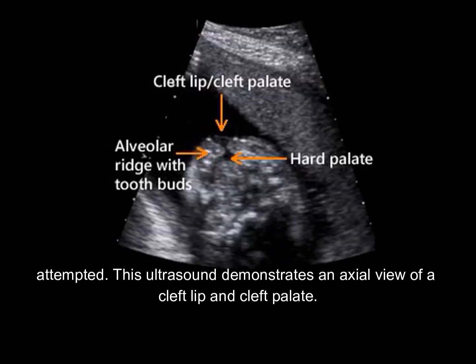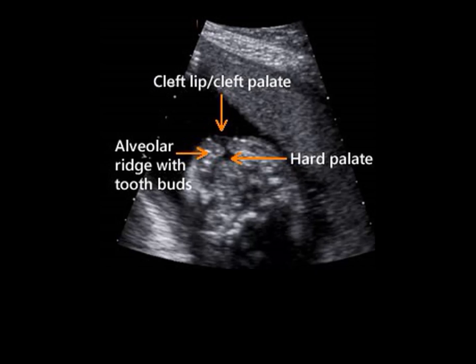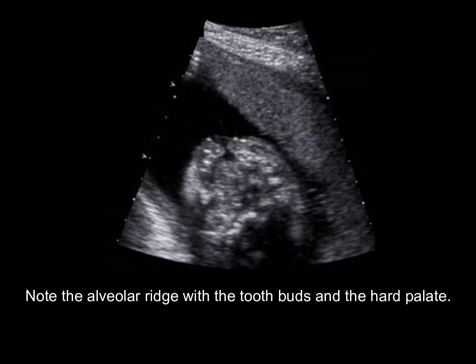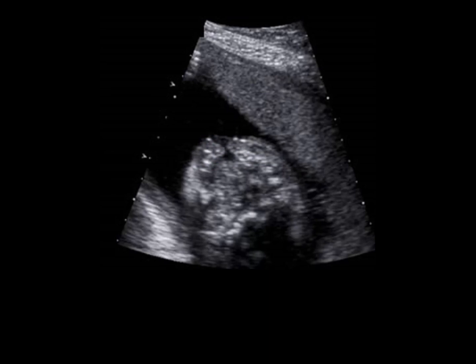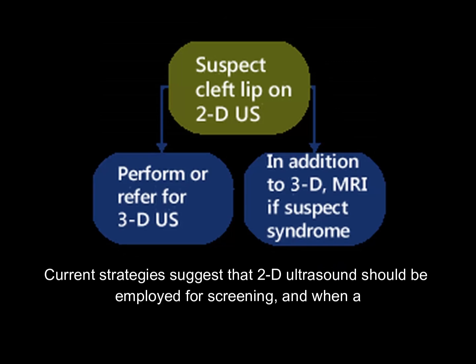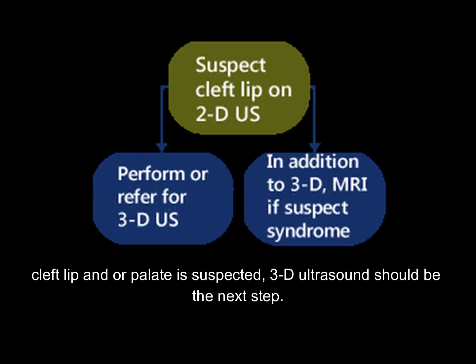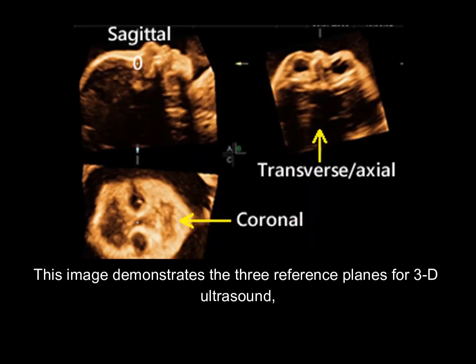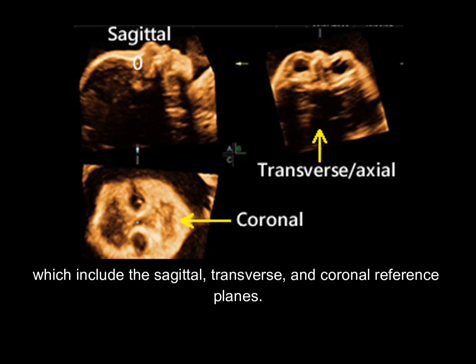This ultrasound demonstrates an axial view of a cleft lip and cleft palate. Note the alveolar ridge with the tooth buds and the hard palate. Current strategies suggest that 2D ultrasound should be employed for screening, and when a cleft lip and/or palate is suspected, 3D ultrasound should be the next step. This image demonstrates the three reference planes for 3D ultrasound, which include the sagittal, transverse, and coronal reference planes.